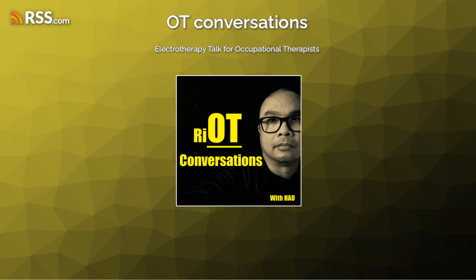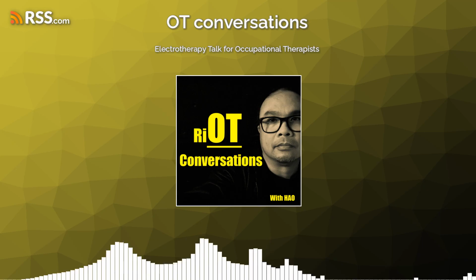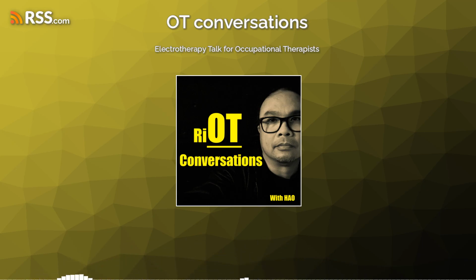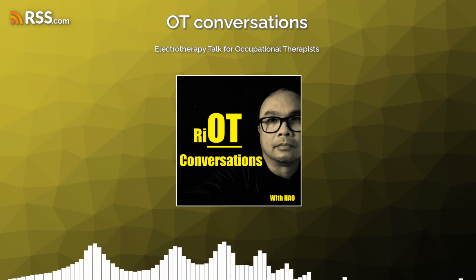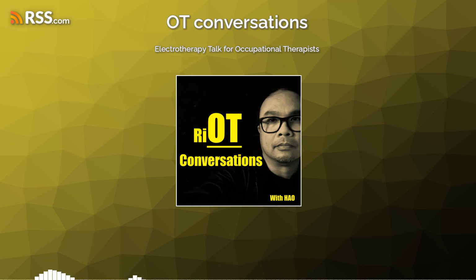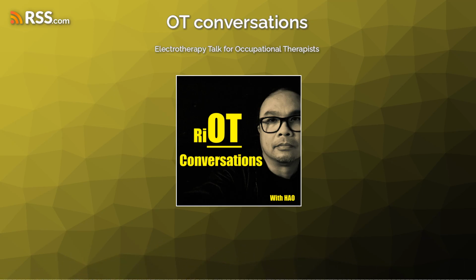All right. So another type is the microcurrent therapy, and this uses very low electrical currents, and what it does is it stimulates cellular repair, it reduces pain, it promotes healing, usually used for soft tissue injuries or chronic pain. So they might call it microcurrent therapy. That's one of these new terminologies, but technically it's TENS, isn't it? TENS would have been microcurrent as well.